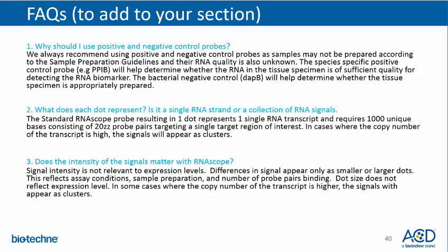So they can be set up front. And as such, clusters will be broken down into the number of dots with the selected settings that can fit into that cluster. This is not necessarily the same for other software, but this is how HALO software deals with clusters and getting a dot count out of them.